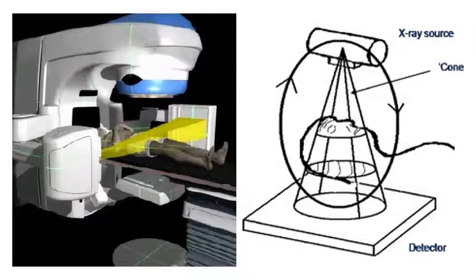The KV systems on linear accelerators, when rotated and imaging at the same time, produce a cone beam image set which can be reconstructed to create a 3D image. The accelerator system must be rotated at speeds that are much slower than for a diagnostic CT machine, speeds of around 1 revolution per minute, which can cause motion artifacts. As well, the detectors used for linear accelerator-based cone beam systems, or CBCT, do not have certain scatter reduction features used in diagnostic units. For these two reasons, CBCT systems do not have as high an image quality as diagnostic CT systems, but they nevertheless have much superior contrast than planar X-ray imaging systems.